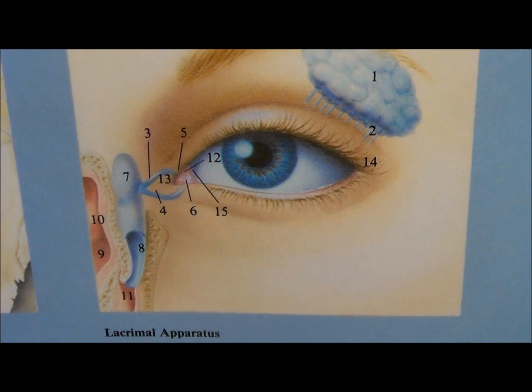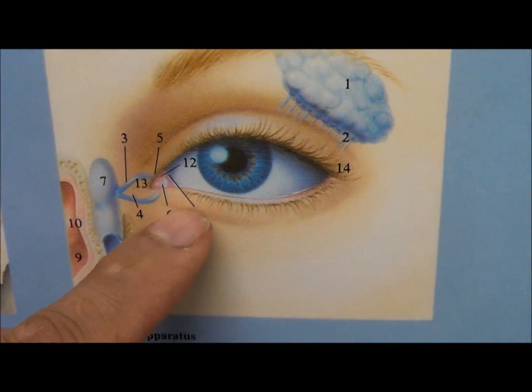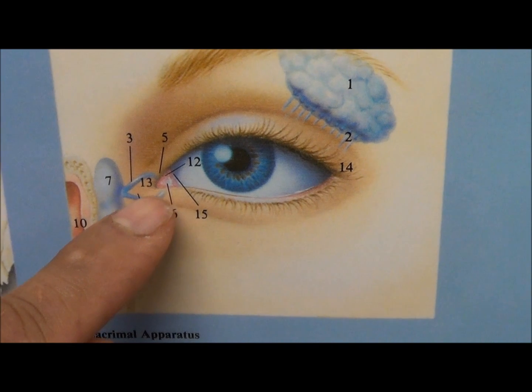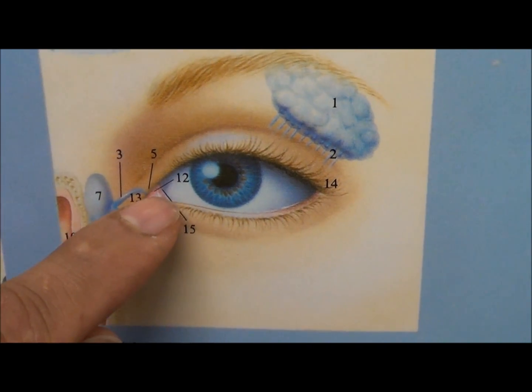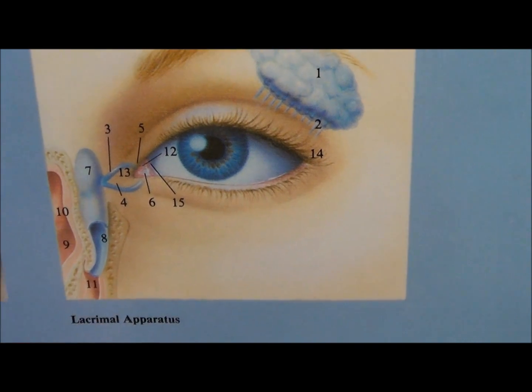I want to show you what we actually do when we do tear duct surgery. These are the tear ducts. There's a small opening in the lower lid and an opening in the top lid, and those two join into this common system that's within your nose.